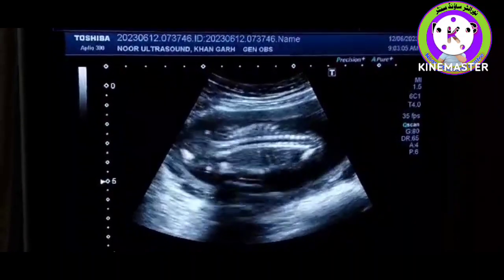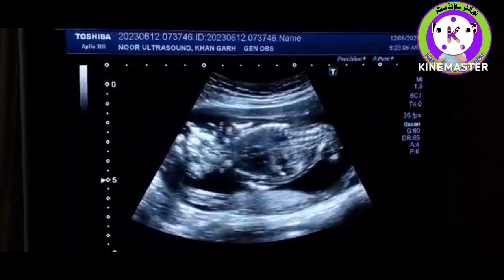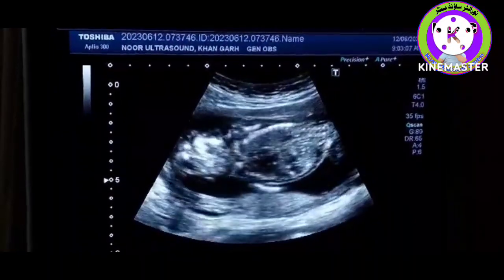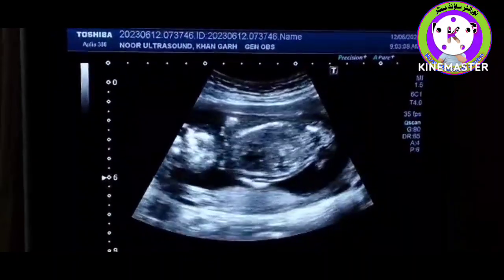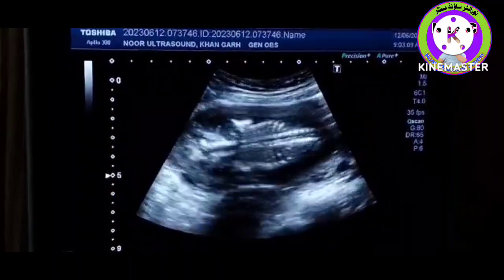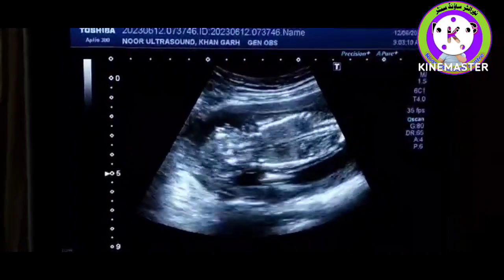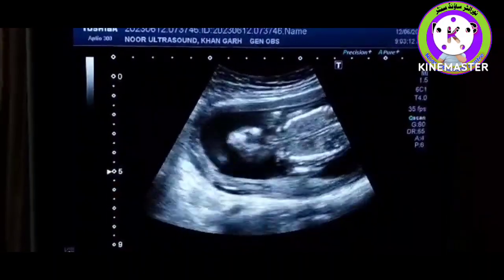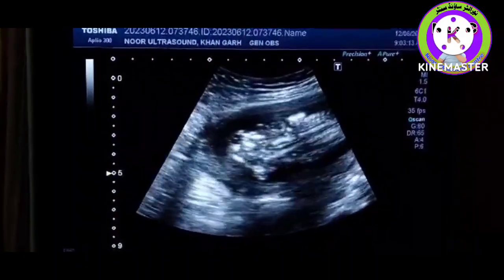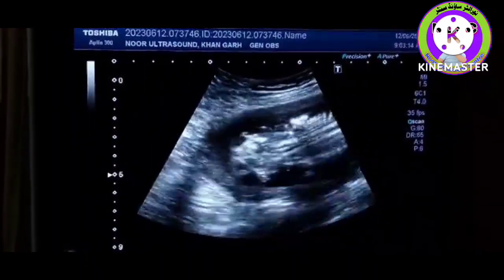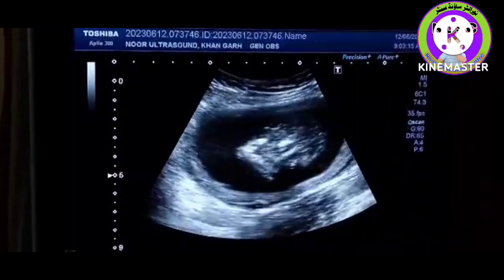Here we are performing an obstetrical scan, as you see here. This is the fetus. We come to the head of the fetus.